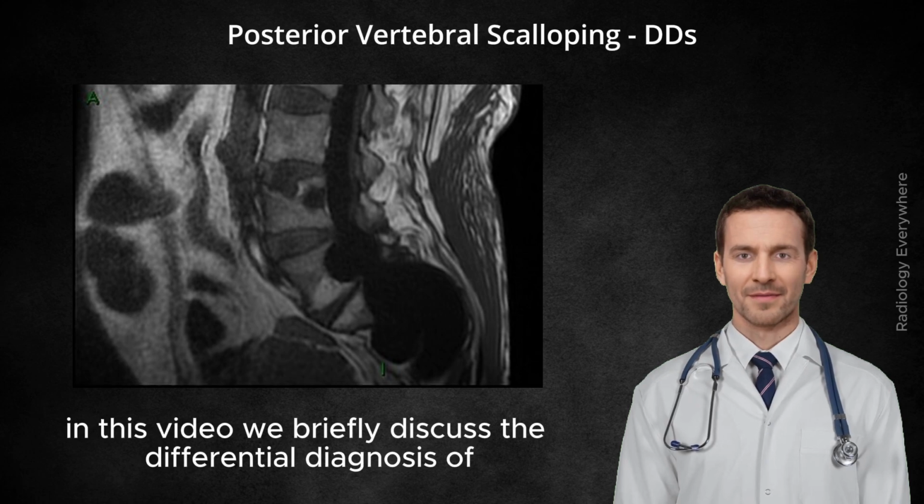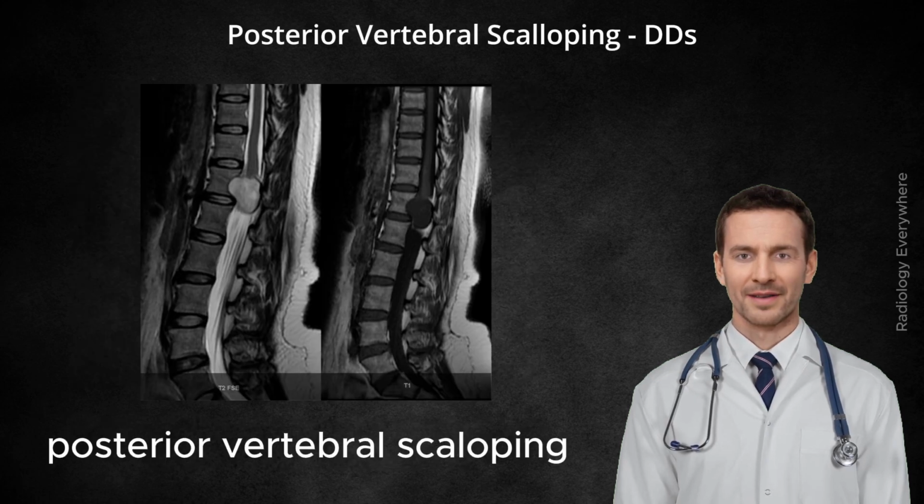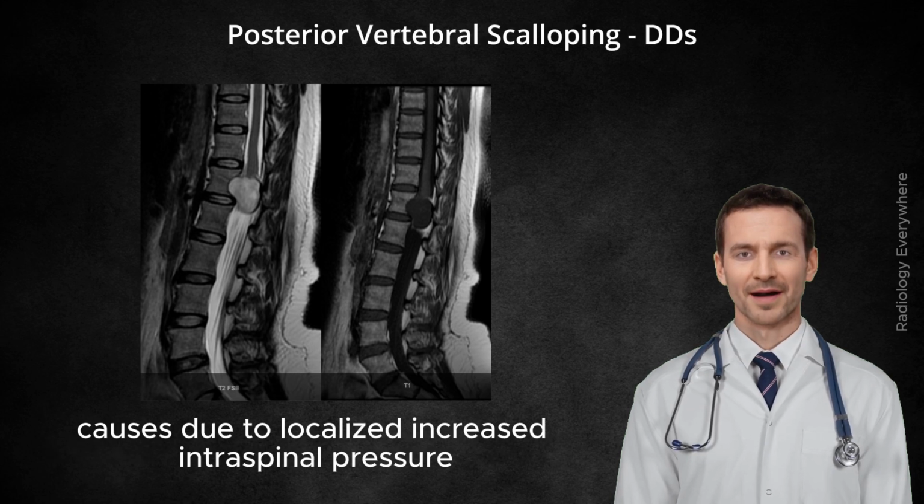In this video, we briefly discuss the differential diagnosis of posterior vertebral scalloping. Causes due to localized increased intraspinal pressure.